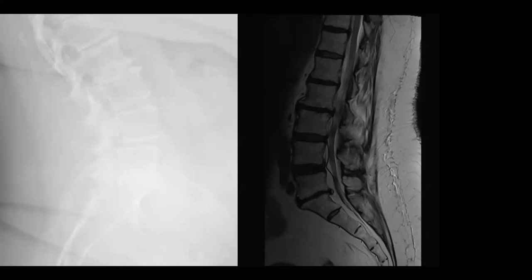The main indication for the device remains chronic axial lower back pain with an element of multifidus instability, clinically and then radiologically, some wasting being present, without frank neural compression, or clinically without neurological pain radiating below the knee. So you can consider it as a prehabilitation option, which is getting a little outside its initial indications, something that we've been doing a bit of in terms of deformity surgery. But I think this patient, I'd be a bit hesitant to offer a ReActivate to as the primary treatment.